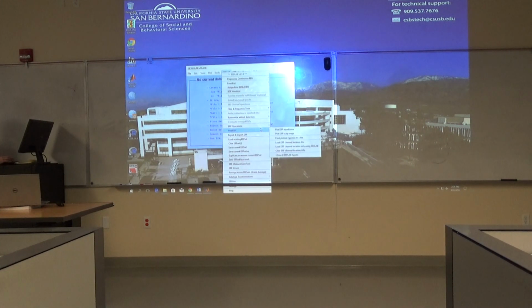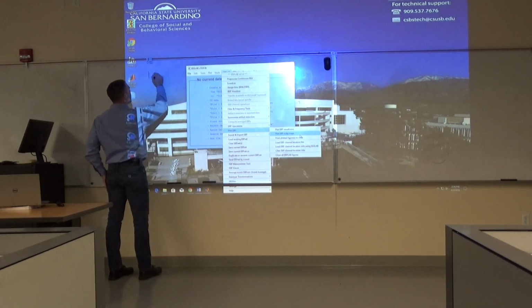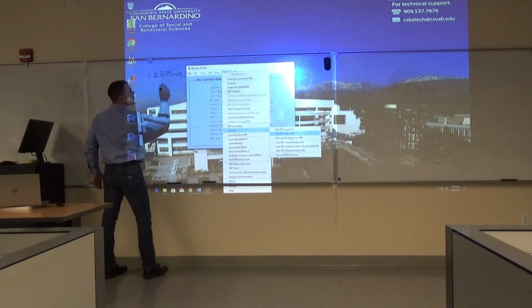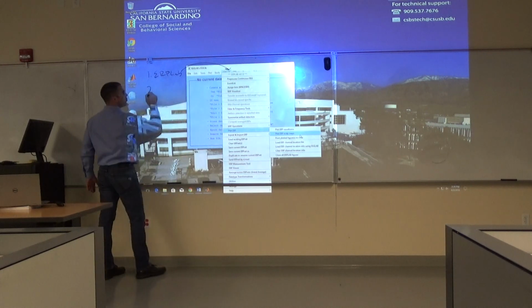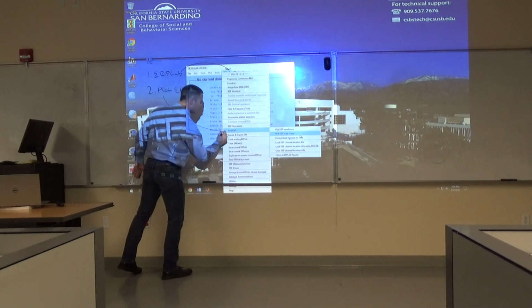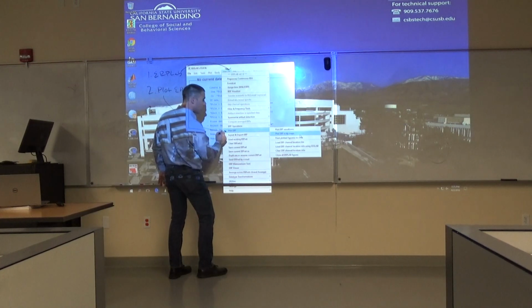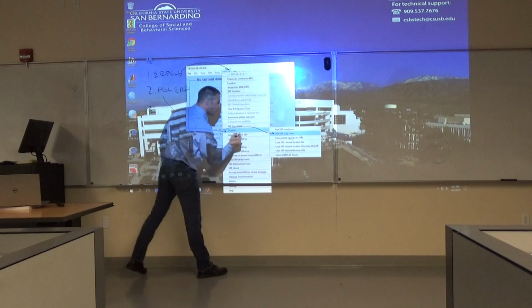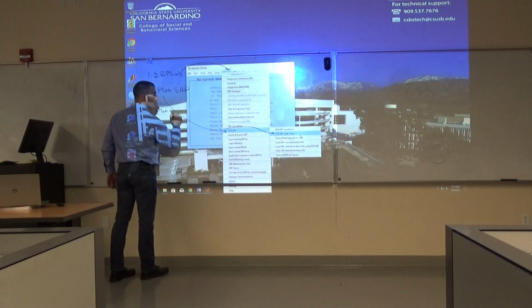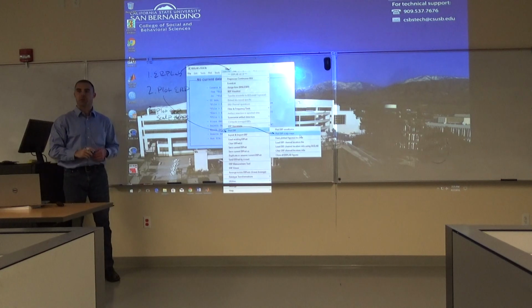Now you're going to go to Plot ERP. You're going to go to Plot ERP Scalp Maps. Okay? So here, we're going to do 1 is ERP Lab. 2 is plot ERP. 3 is we're going to go to plot ERP scalp maps. Is everybody able to get there?